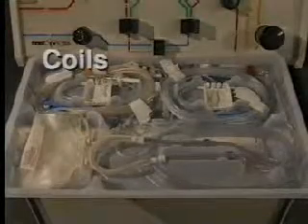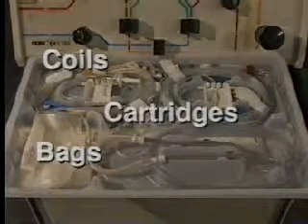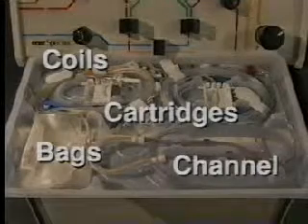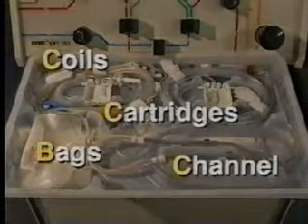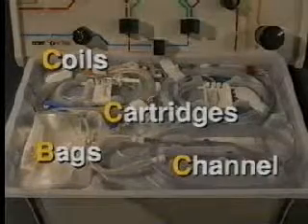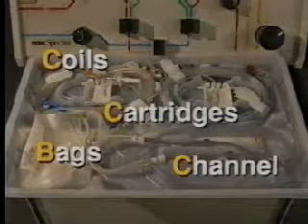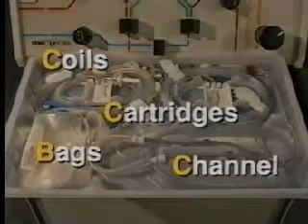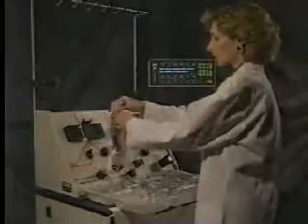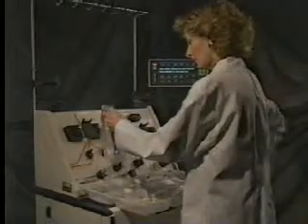Unpacking the various components of the disposable set in the correct order is essential to a smooth and easy loading operation. As a helpful reminder, we will introduce an expression known as CBCC. CBCC stands for coils, bags, cartridges, and channel. This refers to the order in which the disposable package should be unpacked. Begin by removing the coils. Lift the inlet line coil and remove the white paper tapes.